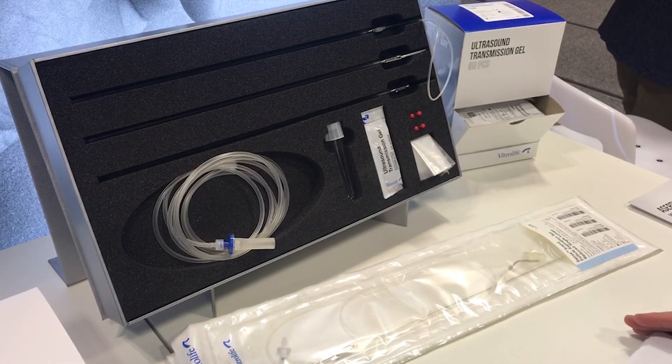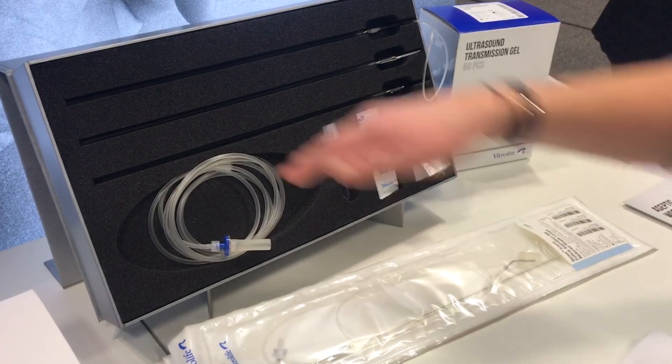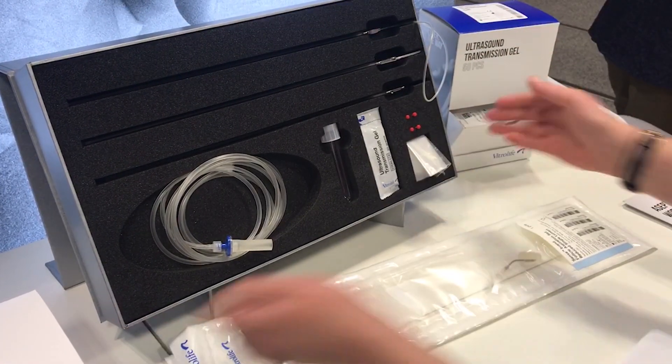I'm Kate Bennett, one of the account managers in the UK, and I'm just going to talk you through this OPU pick-up kit.